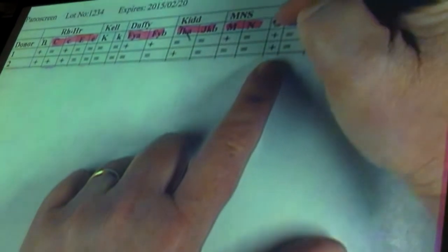Okay? How about big S? Big S doses with little s. But big S is homozygous. So you can eliminate it. Okay? Then you need to go down to your next negative cell. Number 3 is positive in the AHG, so I have to ignore it. Number 4 is negative. Then once they're eliminated, you do not have to look at them again.